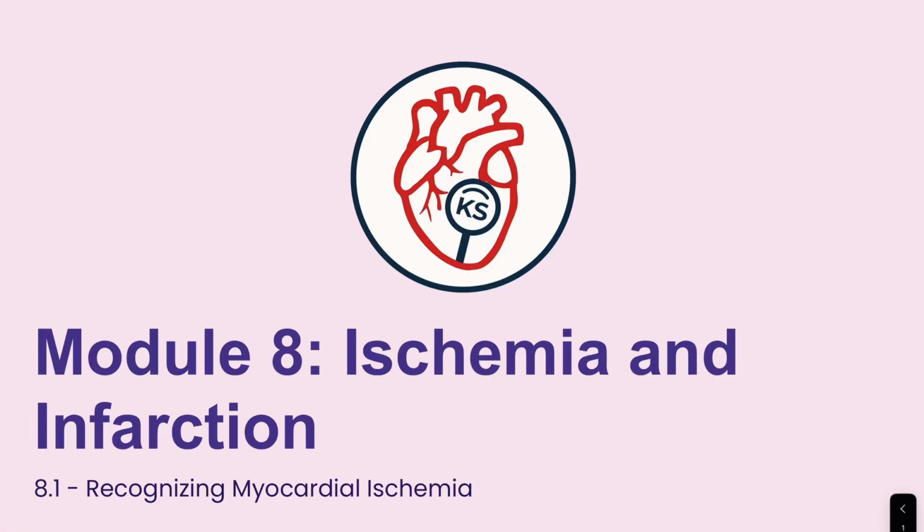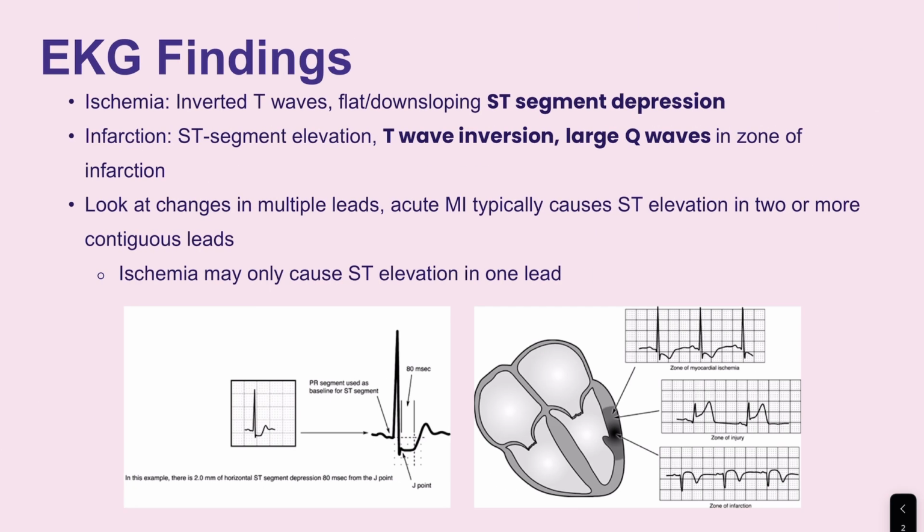Ready, welcome to Module 8. This is Ischemia and Infarction. This is going to be our last content module, and then the next ones in the series are going to go over more practice problems and things like that to help you out. But let's talk about some EKG findings.